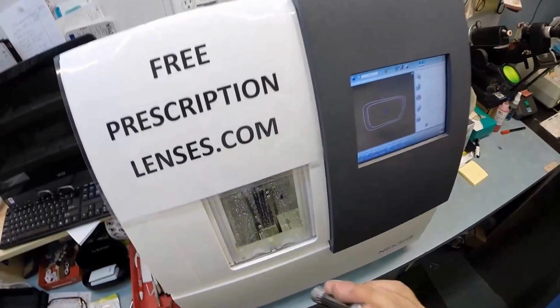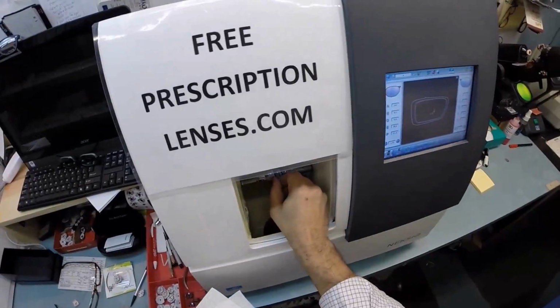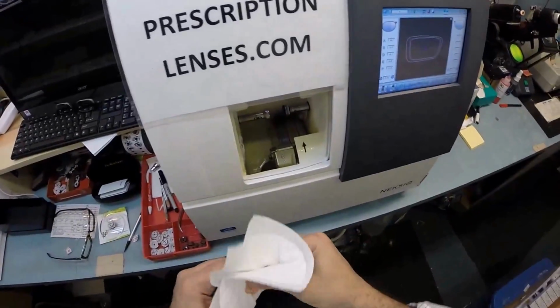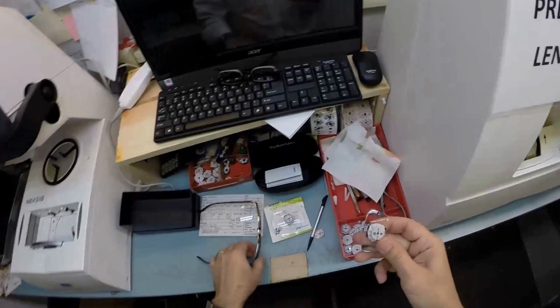Now in just a moment the door is going to open and I will take your lens out and we'll see if it will mount first time around. I do want to grab a paper towel and dry your lens off so it is not slippery. And we'll see if it mounts into the frame first time around. I just want to make sure all the optical debris is missing from the frame.